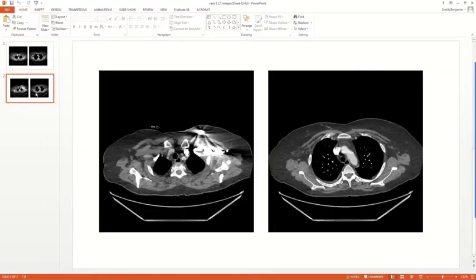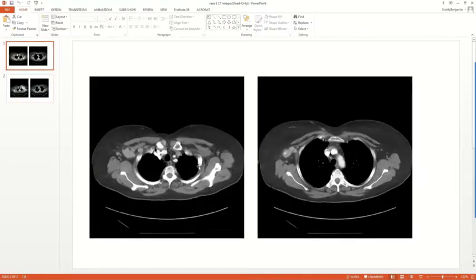Thank you. So really amazing story for this patient. Wanted to show just a few representative slices from her initial CT. I trained at a great place, but in my 4 years of residency, never once did I see N3C disease. In retrospect, I'm sure I did, but we just didn't look for it, and so we didn't see it. But this patient had N3C disease. I don't think we have a great image of the N3C disease, but here is an infraclavicular node. So that is a bona fide nodal metastasis from breast cancer.